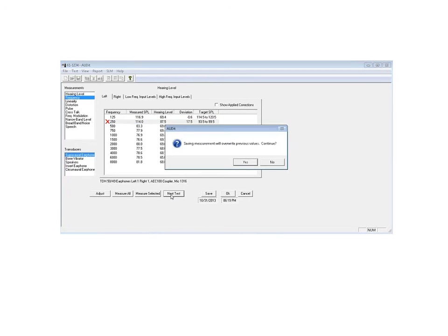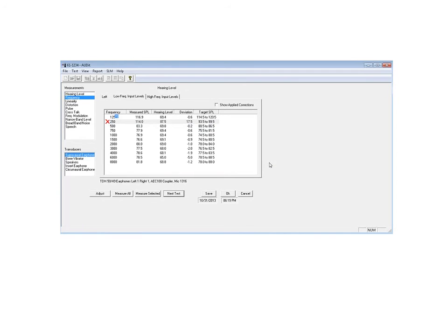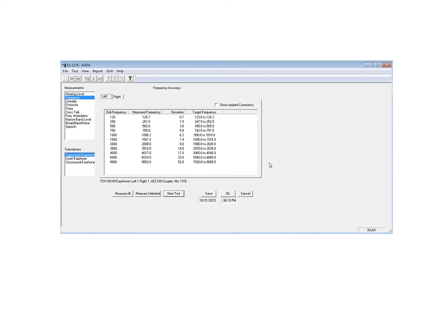It prompts me to save some data, and I'm telling it no, I don't care to save this data. And as it sets up the next test, then again, we could hit measure all.